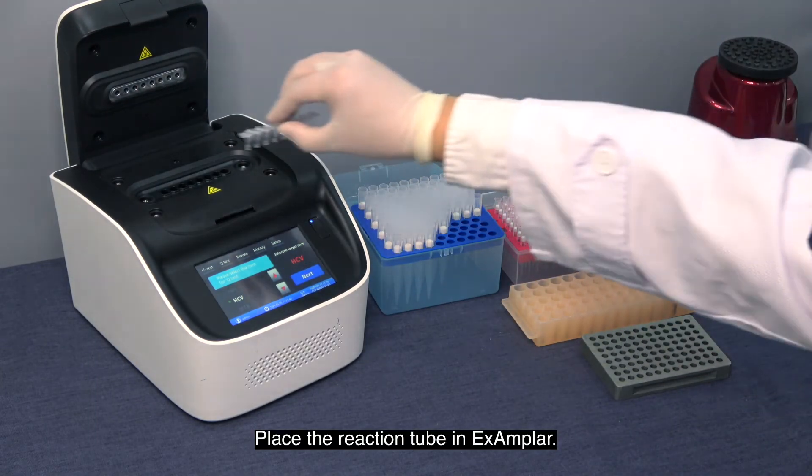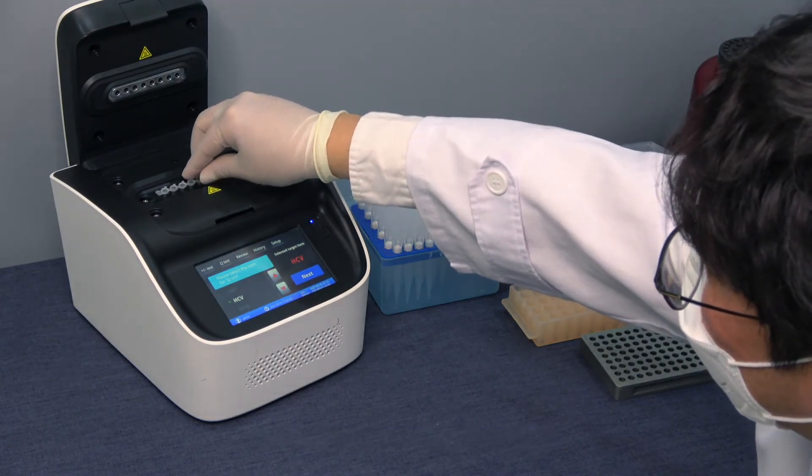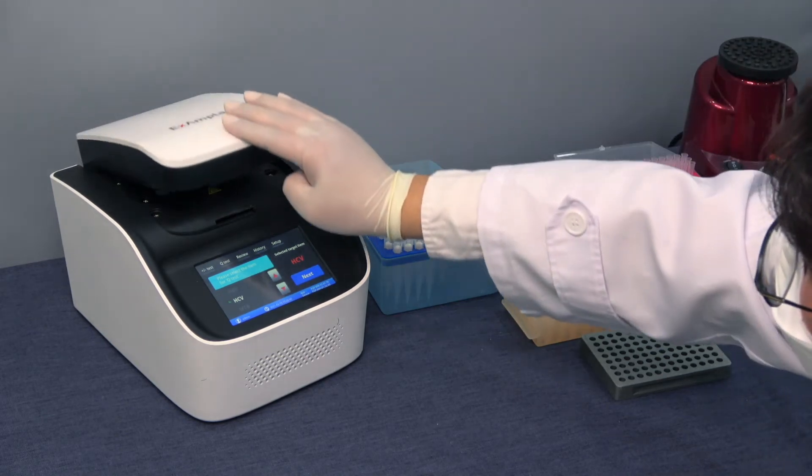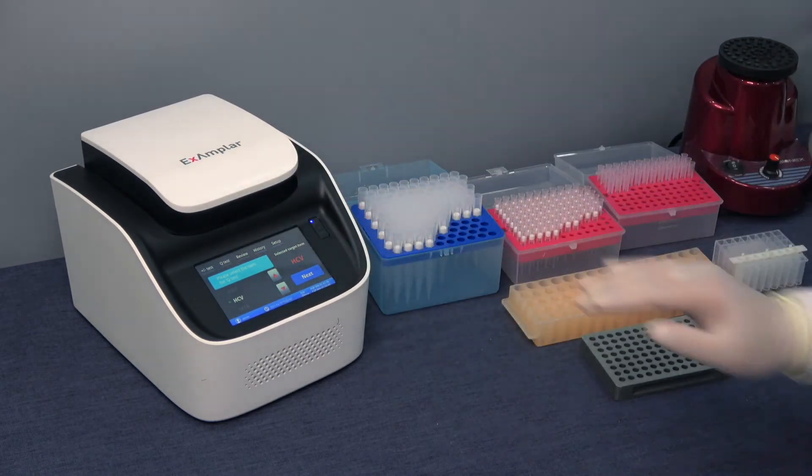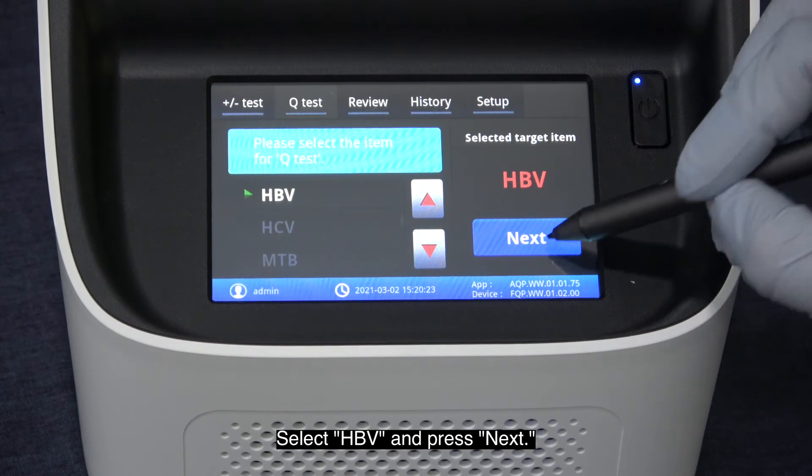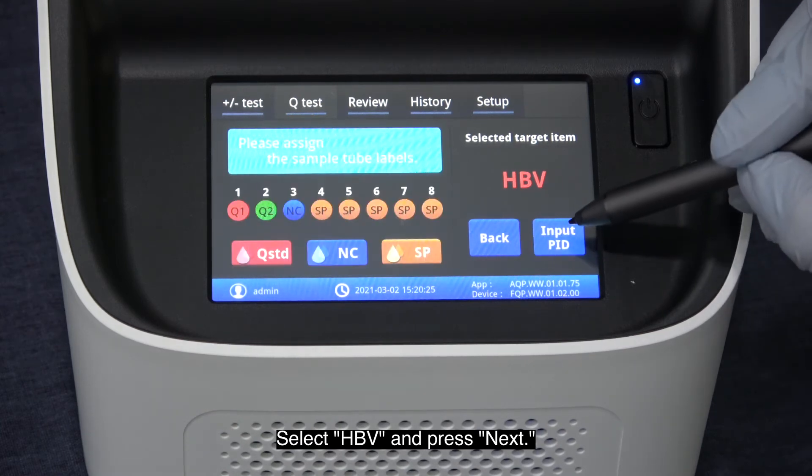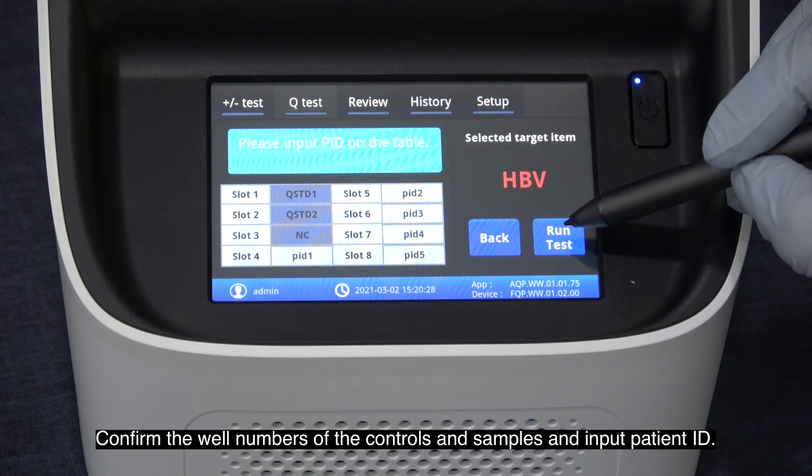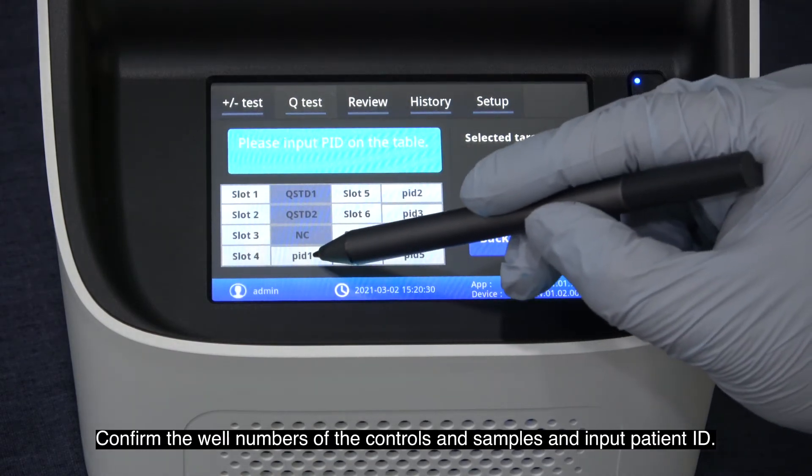Place the reaction tube in XAMPPAR. Select HBV and press next. Confirm the well number of controls and samples and input patient ID.